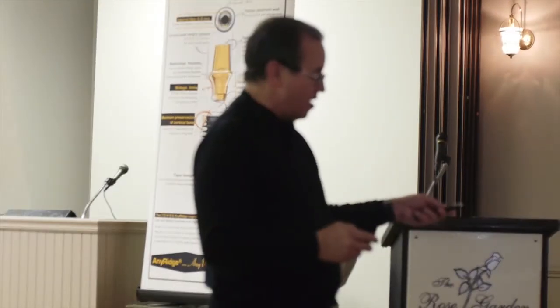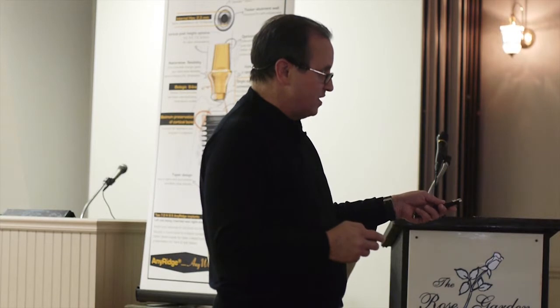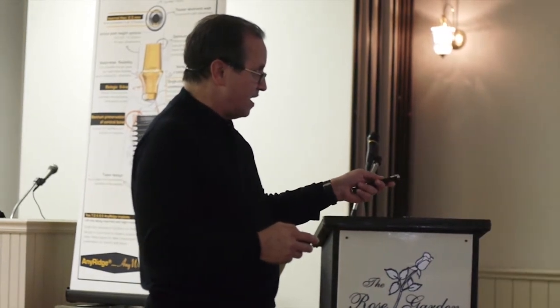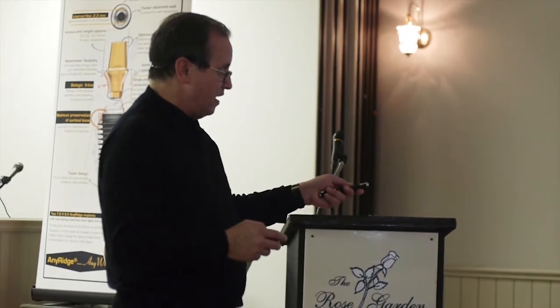This is another example of some immediate loading. I started to show this a little while ago, but I didn't get around to it. This guy presents with this situation here. This tooth is falling apart. We've got a problem with this one as well. And so what you see on the x-ray is this thing's in trouble. This has got a big old lesion going on here. Okay?